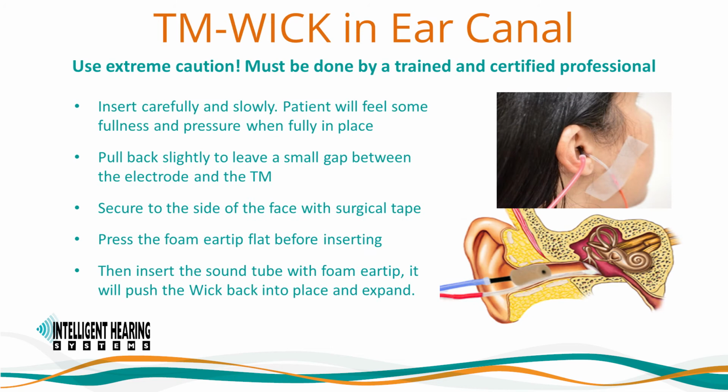Now let's discuss placing the TM-Wick in the ear canal. It is important that this be cautiously done by a trained and certified professional. Carefully and slowly insert the TM electrode in the ear canal. The patient will feel some fullness and pressure when you have reached the tympanic membrane. Pull back slightly to leave a gap between the wick and the tympanic membrane.